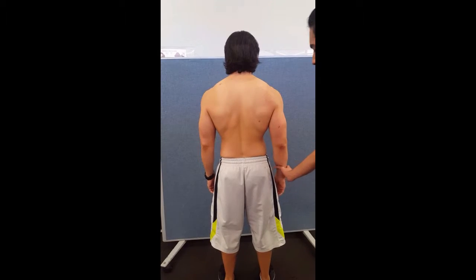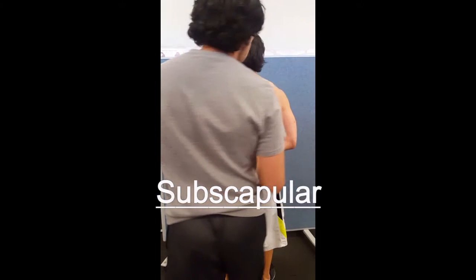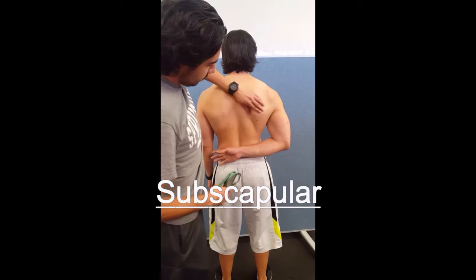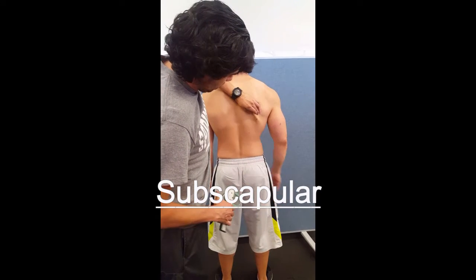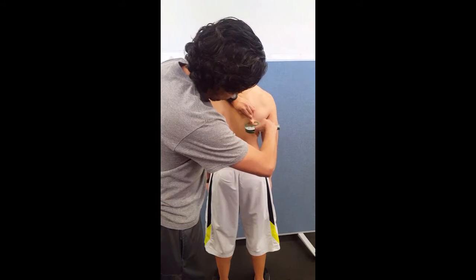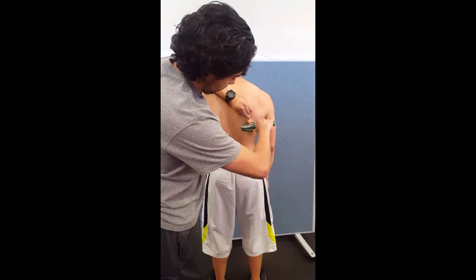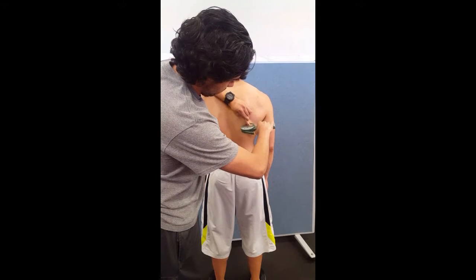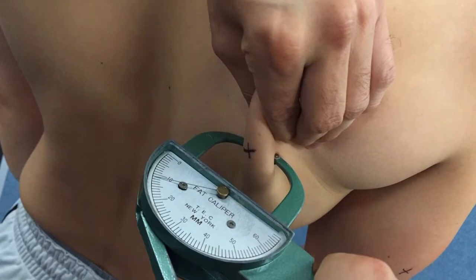Next up, we have subscapular. It is a diagonal fold at a 45-degree angle, one or two centimeters below the inferior angle of the scapula. It will help if the subject puts the arm behind the back in order to find the scapula. Once you have located it, you can ask the subject to let the arm rest on the side and proceed. Take a minimum of two measurements at each site, and if duplicate measurements are not within one or two millimeters, or ten percent, retest the site.